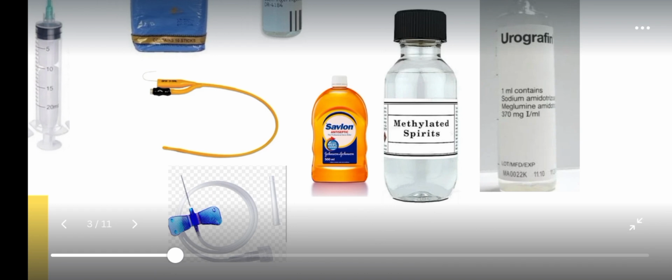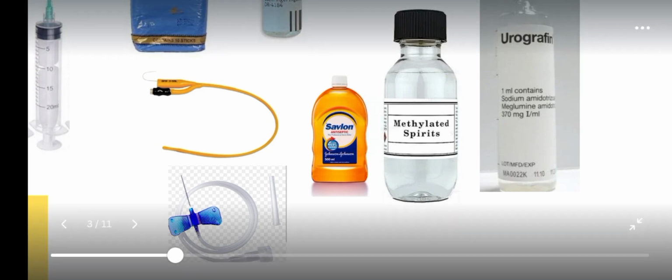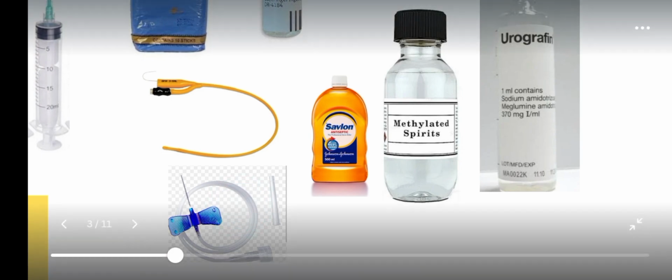We also have this methylated spirit for cleaning the surface where patients are meant to lie, and this is Savlon, also for cleaning. Then we use Savlon to clean our materials and also the patient. This catheter and scalp needle are for introduction of the contrast.